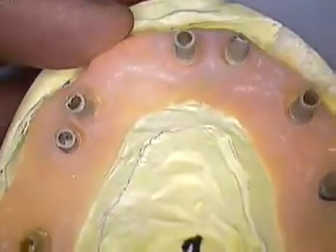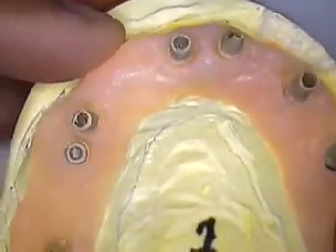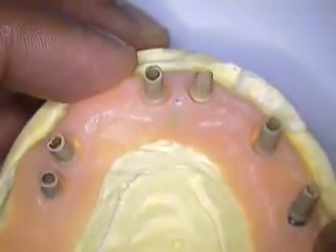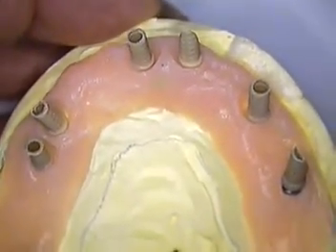So we decided to keep it simple. We're going to go with some titanium abutments from Atlantis, and then we'll have framework fabrication from there, and on we'll go. This is Dr. Jerry Cuomo. I'm going to give you this one video at a time, so just stay tuned for the next one.